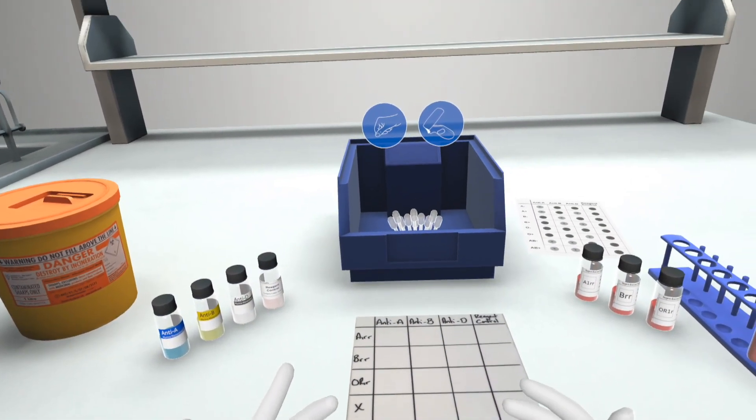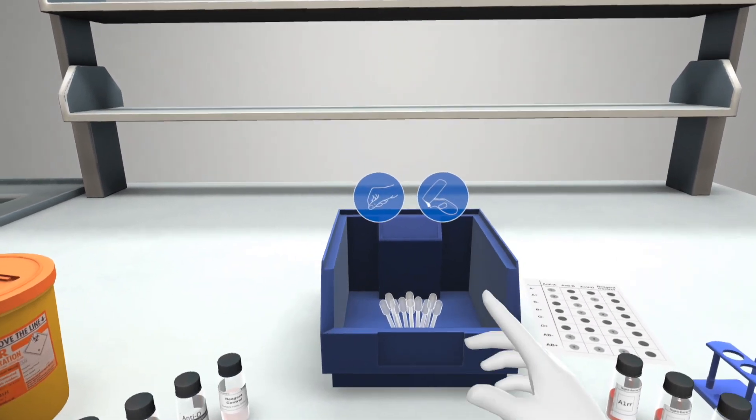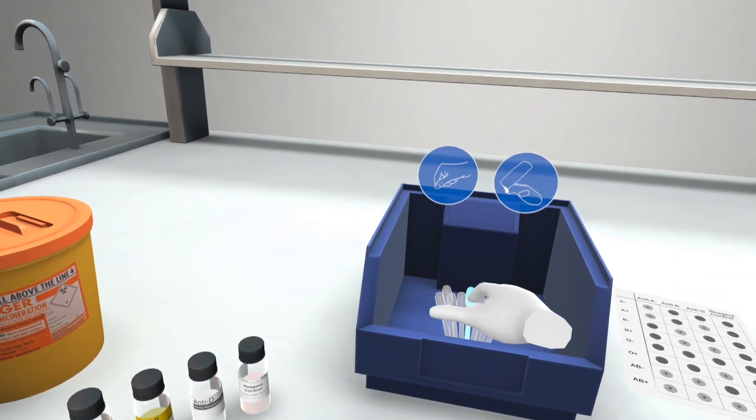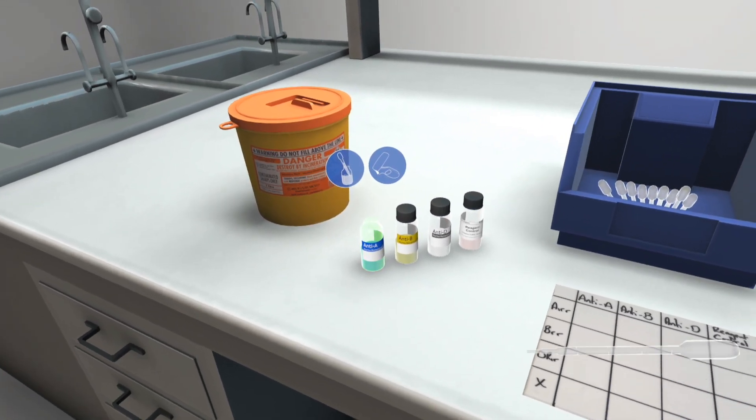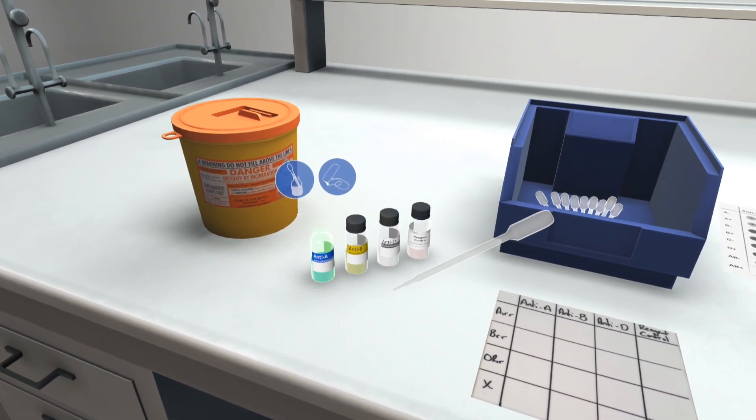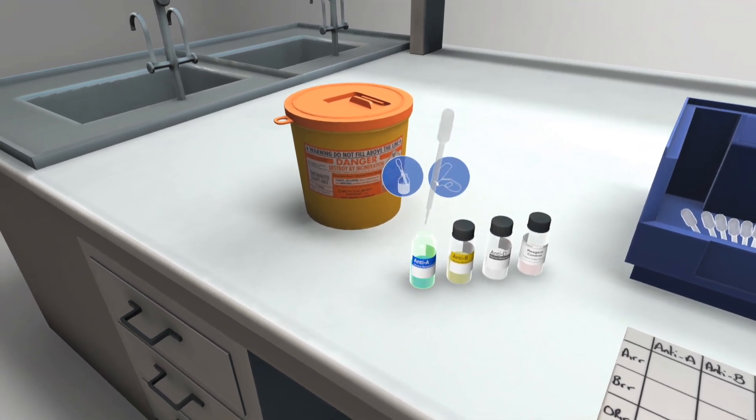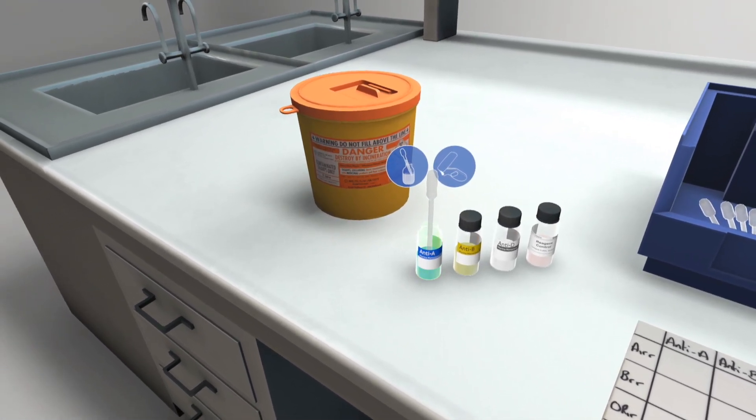Take a pipette from the pipette dispenser by hovering over it and pressing the trigger. Now grab a sample from the Anti-A bottle. Move the pipette over it, hold the trigger, submerge the pipette, then release the trigger in the solution. Try it.